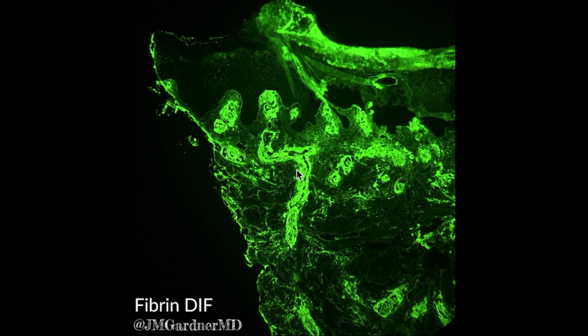So right here we have a nice example of direct immunofluorescence performed on a case of leukocytoclastic vasculitis. And you can see this really bright layer of deposition around each of these vessels. The vessels mostly up here in the papillary dermis and along the superficial vascular plexus. And this is fibrin, and fibrinogen and fibrin will show a lot of deposition in the vessel wall and around the vessels, like you would imagine based on what we've seen on the H&E. And you can see even down in the deep dermis, there's some involvement of the deeper vessels here, and you can see blistering. So this is a case of bullous leukocytoclastic vasculitis, and the depth of involvement raises the possibility of systemic involvement as well.